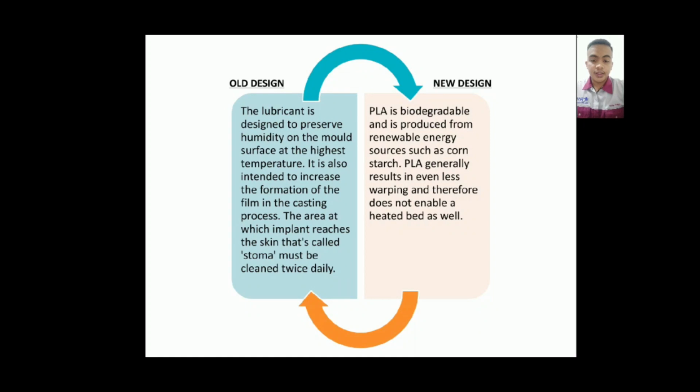Alright, here we can see that in the old design, the lubricant is designed to preserve humidity on the mold surface at the highest temperature. It is also intended to increase the formation of the film in the casting process. The area at which the implant reaches the skin, called the stoma, must be cleaned twice daily.